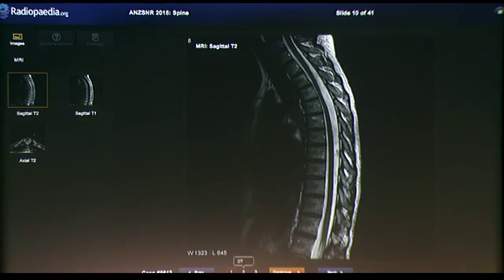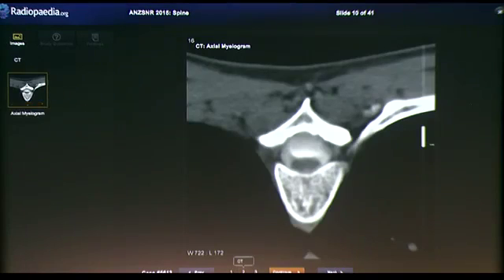Now to prove that, there are a couple of options. One thing you could try is doing a high resolution T2 weighted scan like a FIESTA or CISS through the region to see if you can get a better delineation and identify a cyst wall. Another option would be to do some cine flow studies and better demonstrate that alteration of the CSF flow. The next option is a little bit more invasive, but gives you a pretty picture.